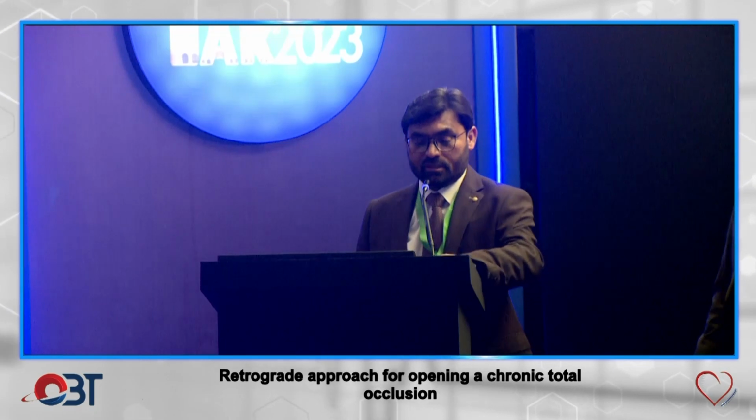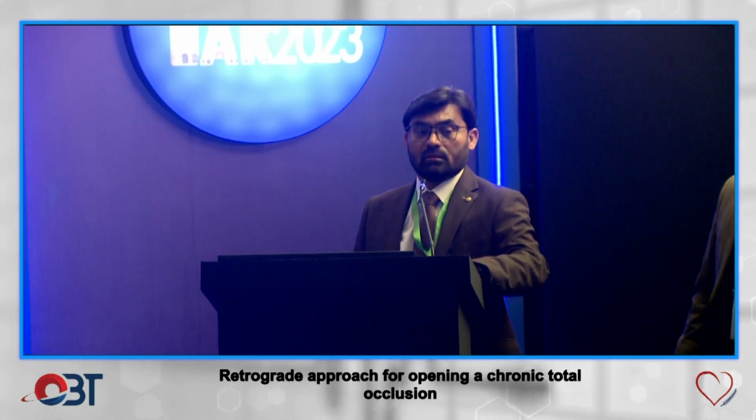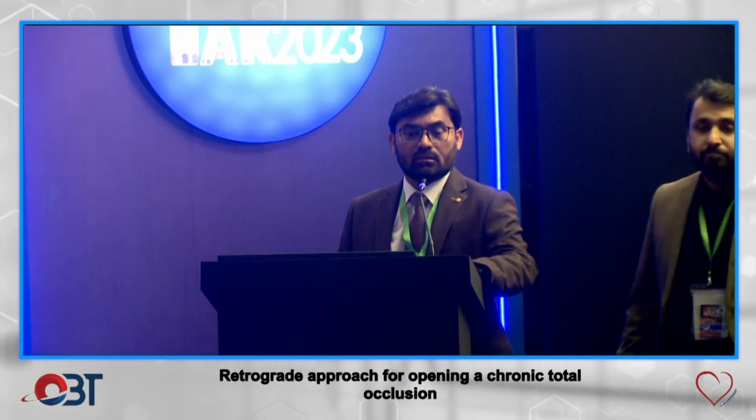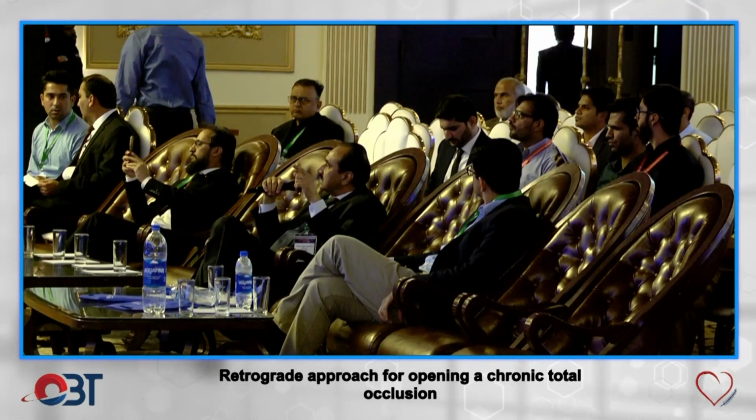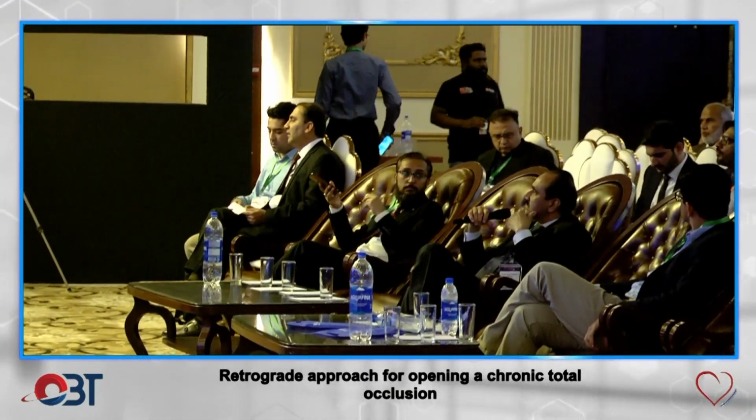Thank you, Dr. Faraz. It's a very nice case done by you. It was a good case, good result. One comment: have you tried the antegrade escalation with the balloon, with the Fine Cross?